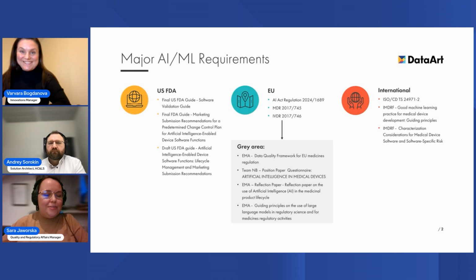As you can see, the situation, at least when considering those two markets, the European Union and FDA, is very interesting. The regulatory landscape for AI-based medical software is evolving and rapidly changing, and we've seen new regulations coming into effect with even more still in the pipeline. And additionally, recently, new guidelines have been finalized.